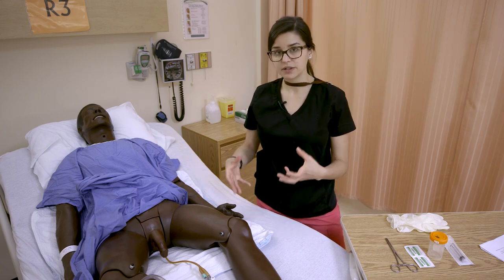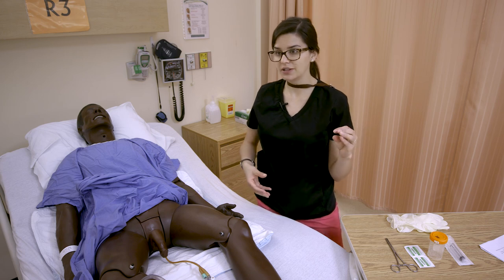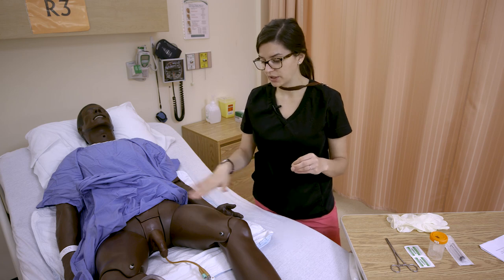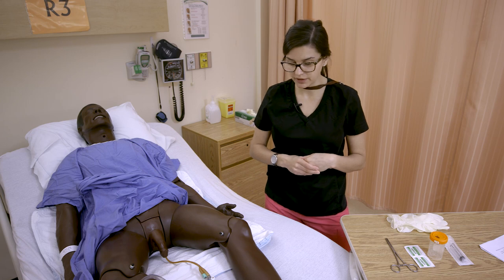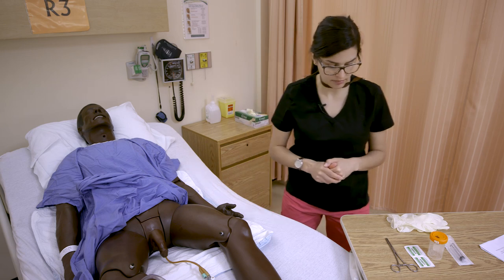In the case of a patient who has a Foley catheter, if we do suspect an infection based on the CAUTI guidelines — catheter-associated UTI guidelines — you would have actually wanted to change the whole system before collecting that sample, if they still required a Foley catheter, just to make sure they're getting a new sterile catheter inserted.